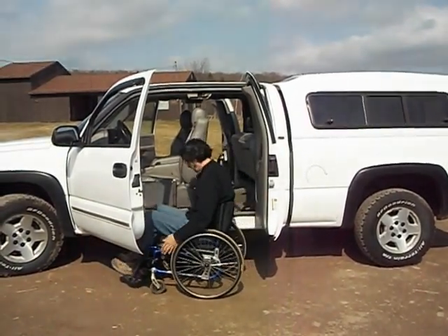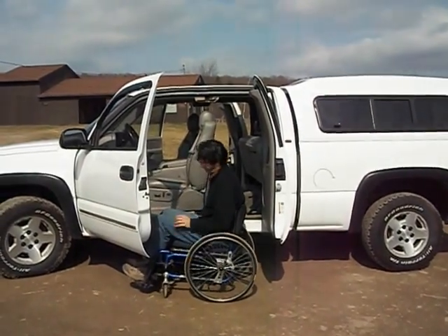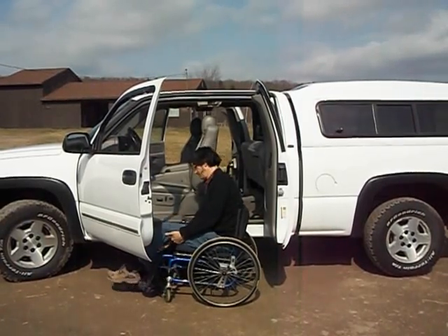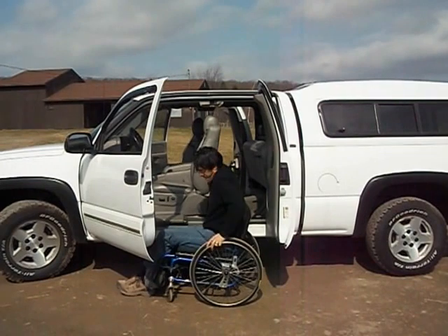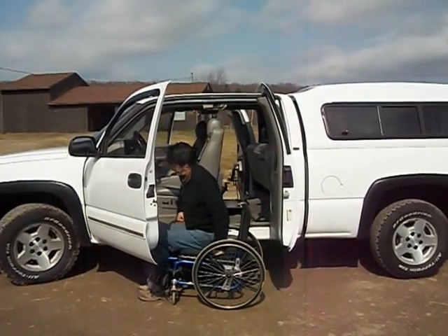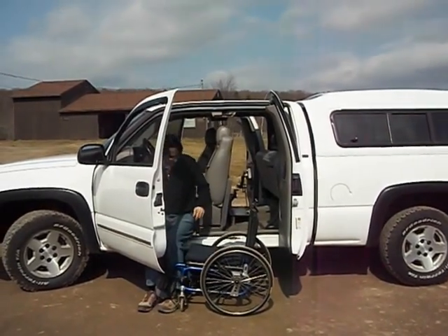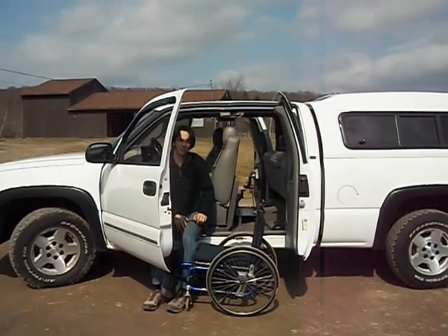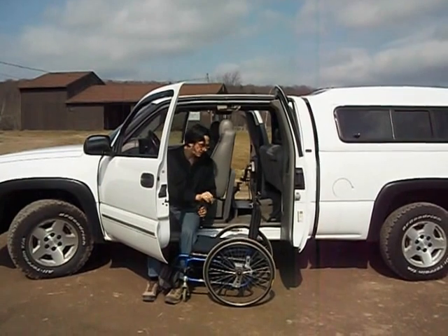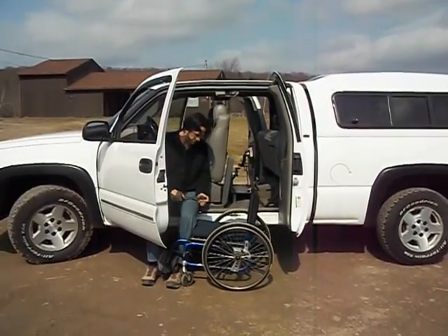We're going to pull right up to the Glide and Go seat and lock the wheelchair brake, then transfer onto the Glide and Go. The safety arm is used to keep us from falling out of the vehicle, but also it can be used to lean forward and maneuver the wheelchair — very handy, very sturdy handle.